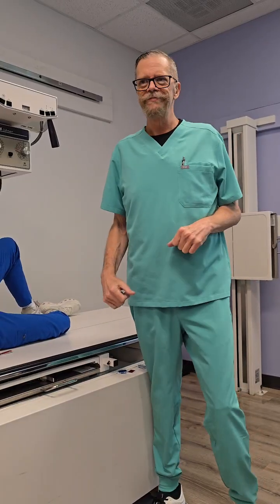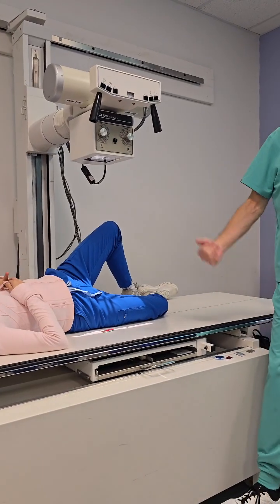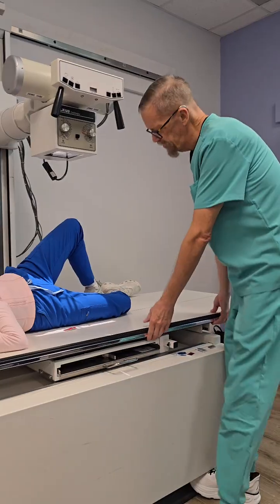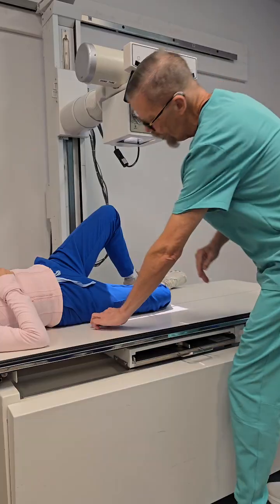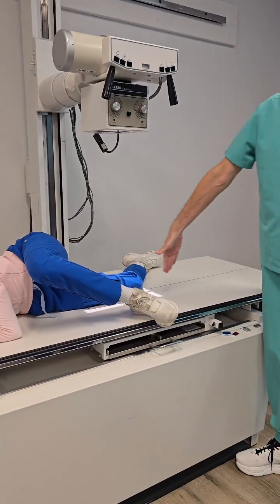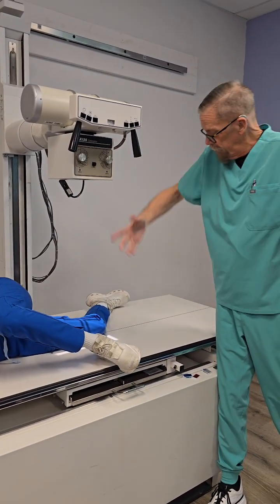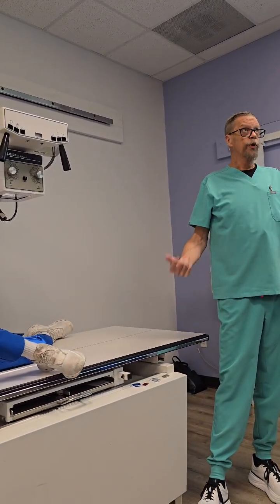That's why I went with the easiest patient in the room — work smarter, not harder. So that's your lateral proximal femur, or proximal lateral femur. Is that a medial lateral or lateral medial? Medial lateral, yes. And all we're left with now is the distal. We're going to turn your hips all the way, bring this leg over the top. Keep that leg straight along that line. Put your marker in there and there's really nothing else I need to do. Collimate down a little bit — that's your lateral distal femur.